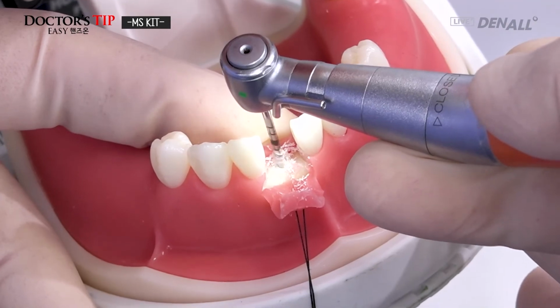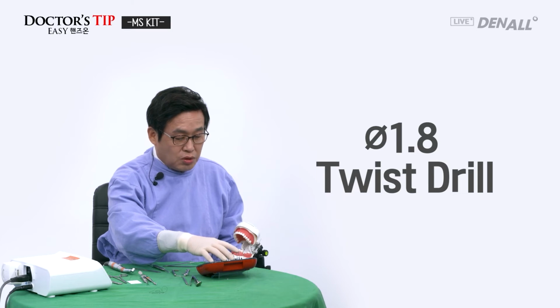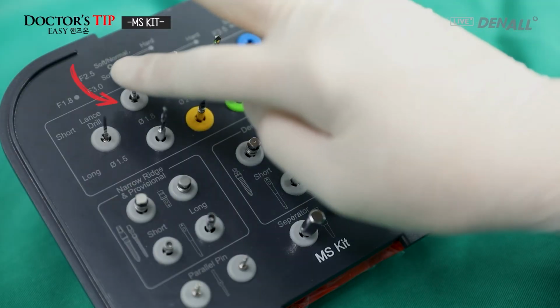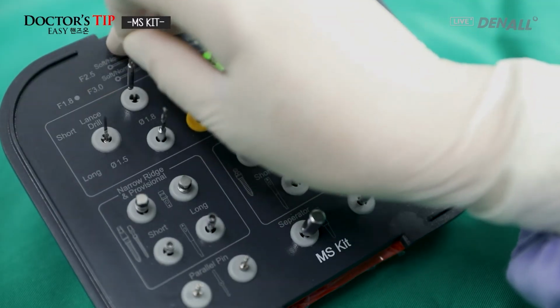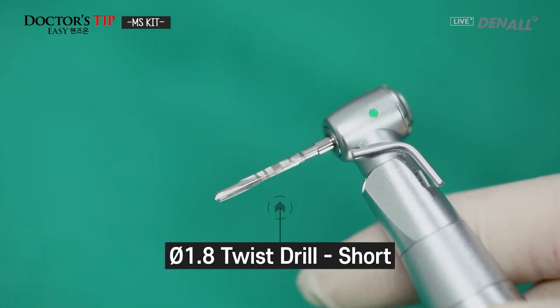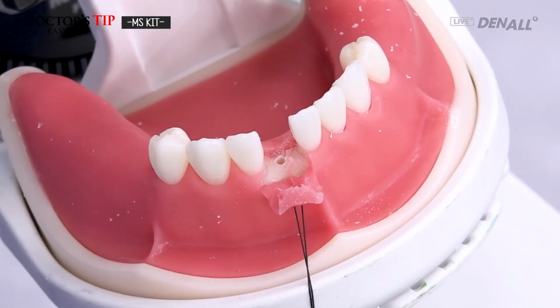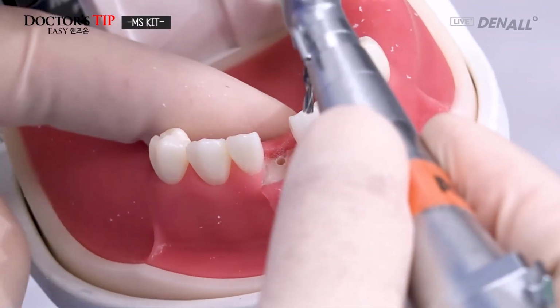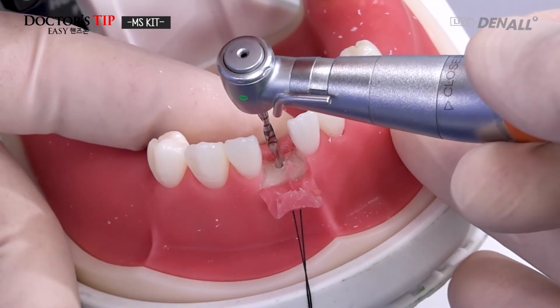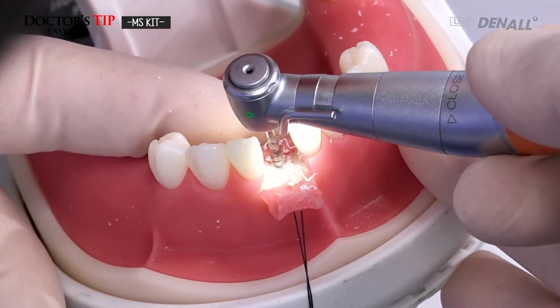Like this, put a hole in the cortical with the 1.8 diameter twist drill. You have short and long versions. I will use the short for my first drilling. So the 1.8 twist drill, like this. RPM, I changed to 1200. And as you can see, in the area I placed, I position it, and the diameter 1.8 twist drill is used.